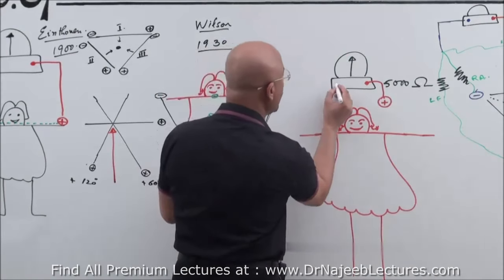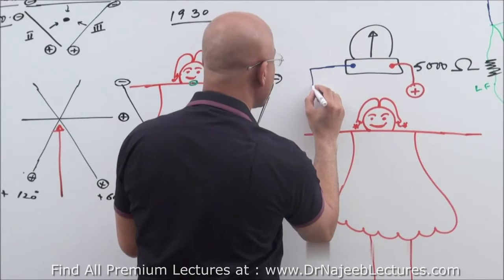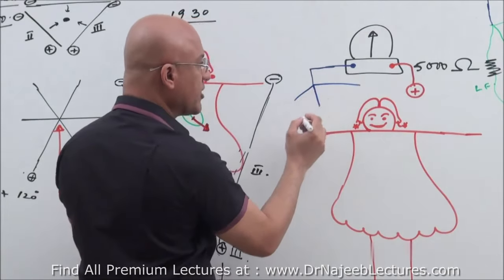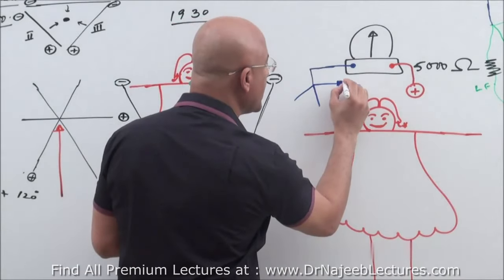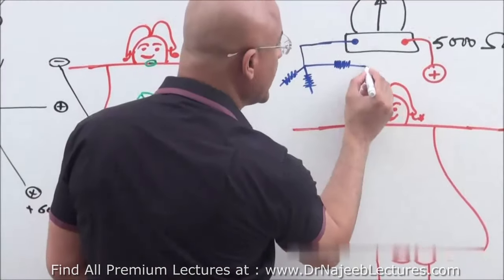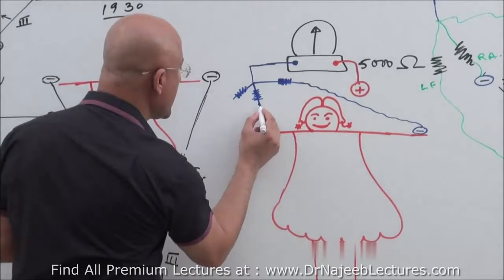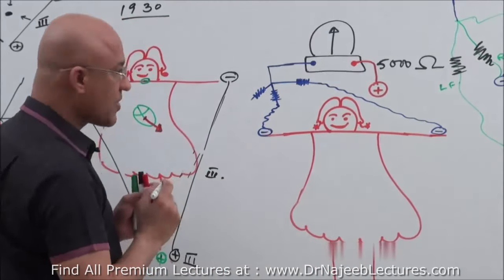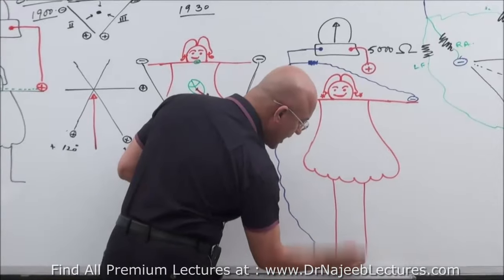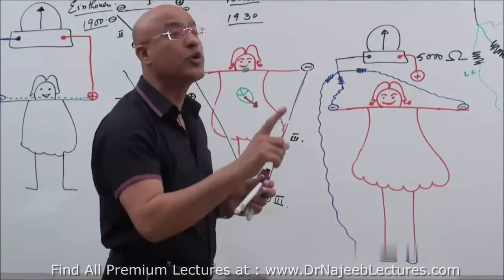And the negative terminal was divided into how many? The negative terminal was divided into three wires, right? And all these wires are having resistance, so minimal current flow should be there. On one side, it was added to the right arm, and this one is added to the left leg. In this way, he was able to construct another triangle, and this triangle is not Einthoven's triangle.